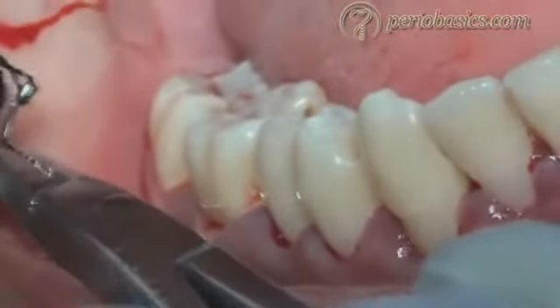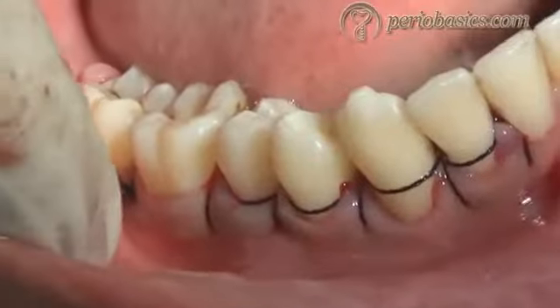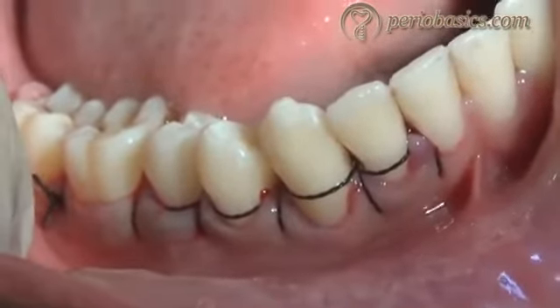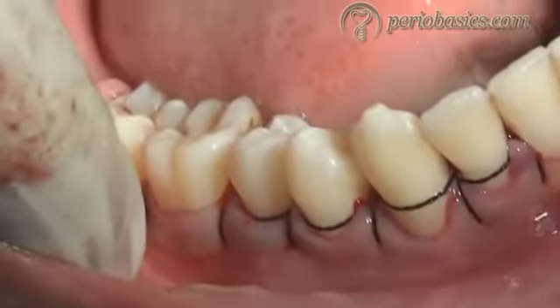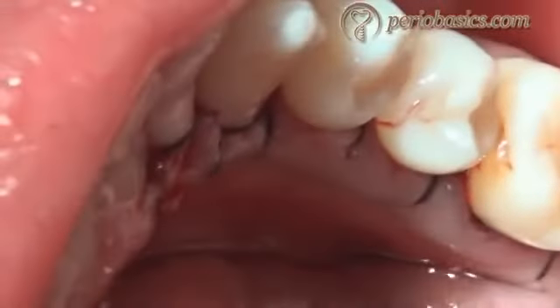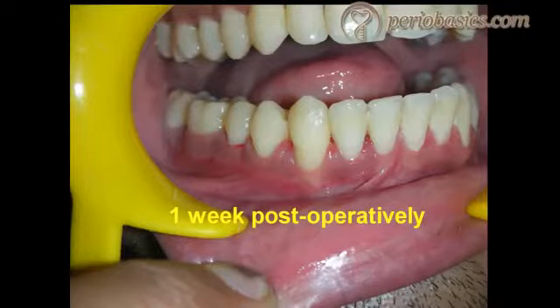and then we go ahead with the suturing procedure. I'm putting a continuous sling suture here, and this is after suturing. You can see nicely placed sutures and the flap is properly adapting to the tooth surfaces. This is from the lingual aspect, and this is 1 week post-operatively.